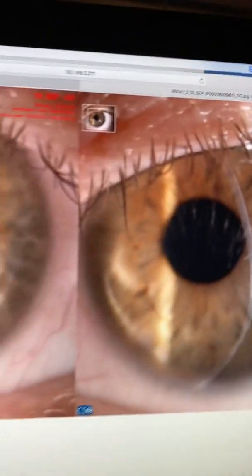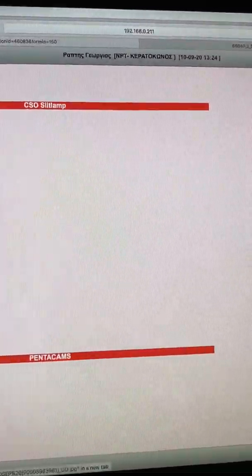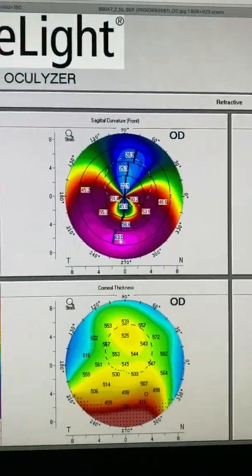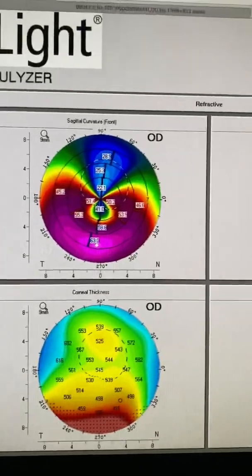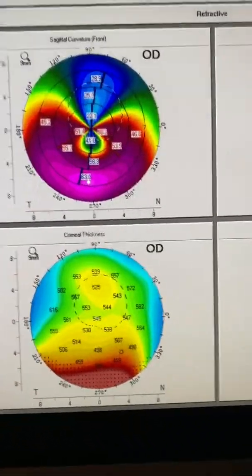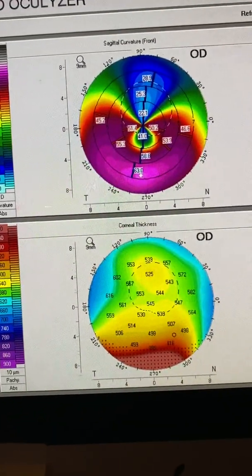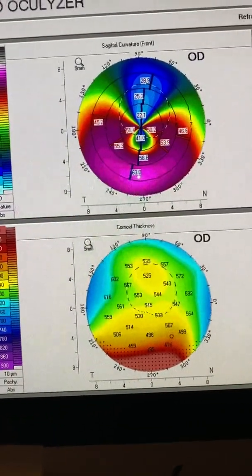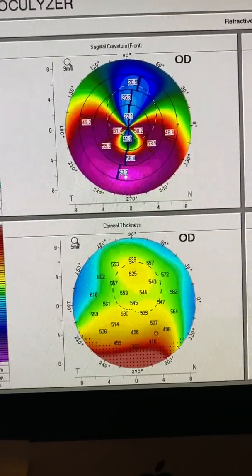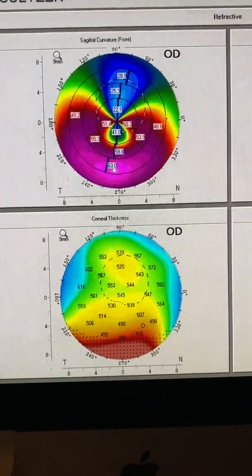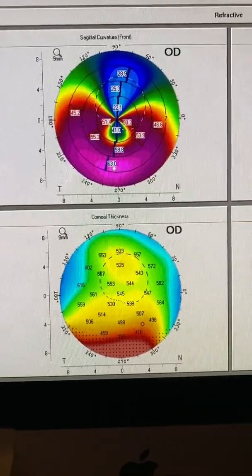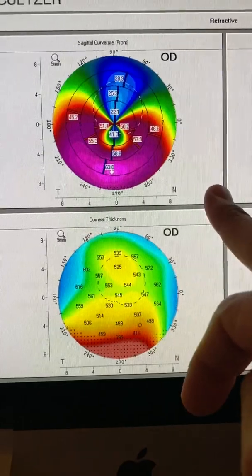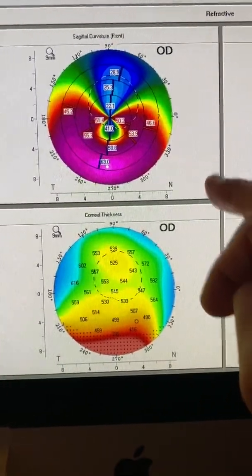So just simple, careful slit lamp biomicroscopy is able to steer us to the right condition. I know I advocate a lot of times that not every claw-like astigmatism on topography is pellucid, but this is probably the case that it is.